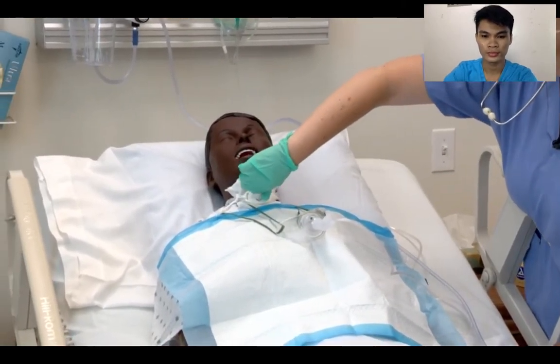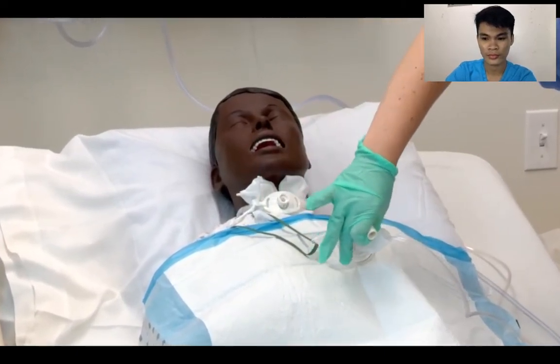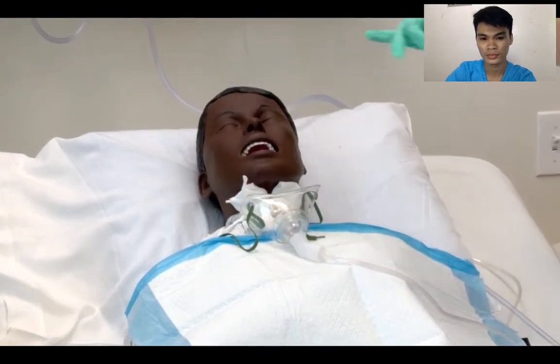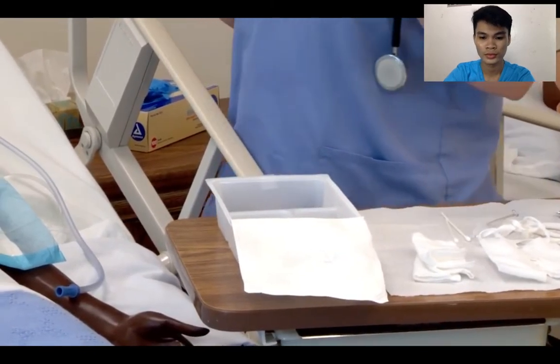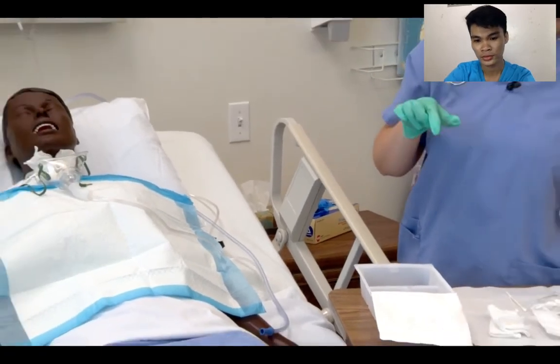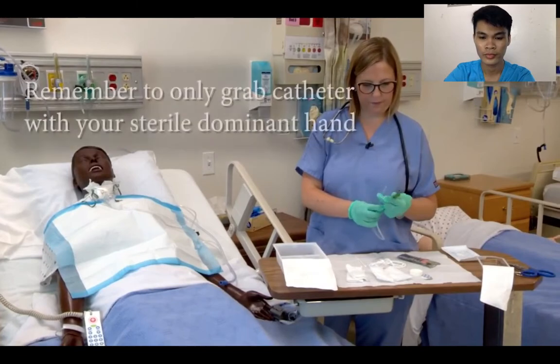I'm going to unlock the trach cannula. Okay, Mr. Jones, take some deep breaths here. I'm just removing your inner cannula. I'm going to clean it. Put that in the 50-50 solution. Okay, now we're going to let that marinate for a little bit. And I'm going to grab my suction catheter and I'm going to prepare to suction the patient.